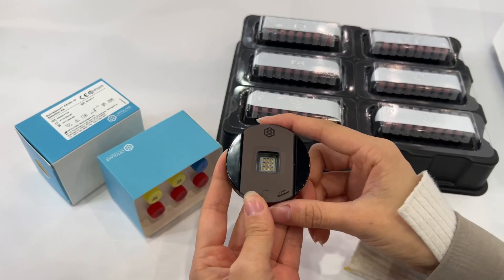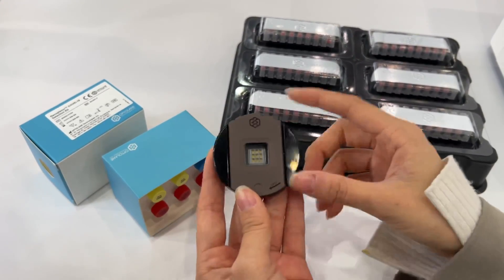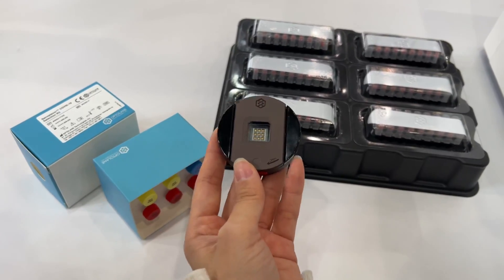This is the only workflow that you have to do before running the test. Then it will go to our analyzers.